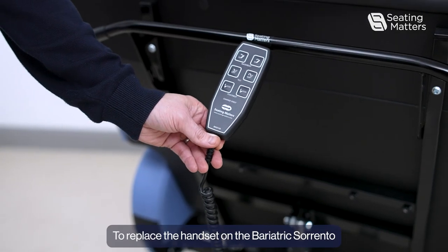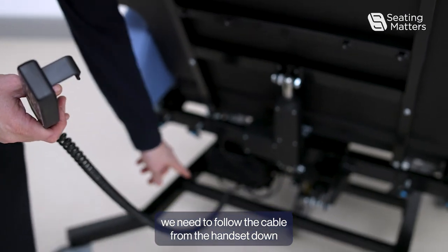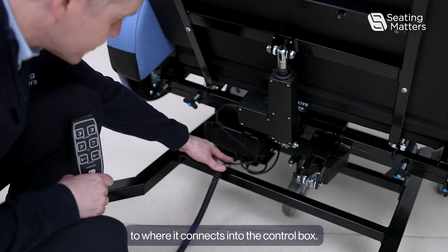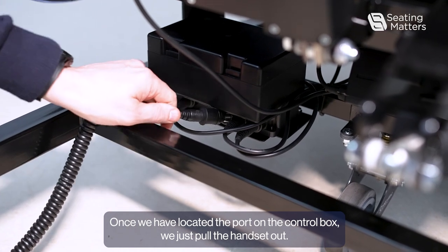To replace the handset on the Bariatric Sorrento, we need to follow the cable from the handset down to where it connects to the control box. Once we have located the port on the control box, we just pull the handset out.